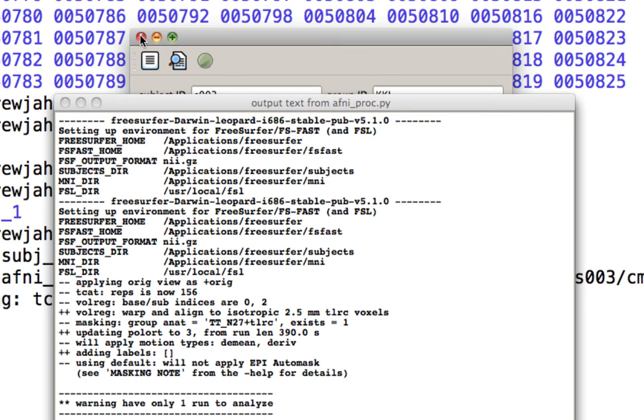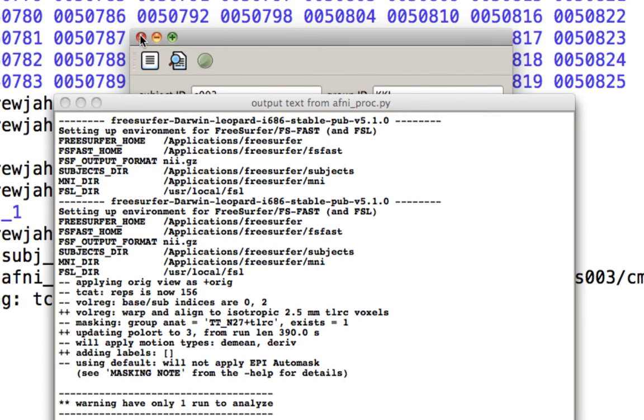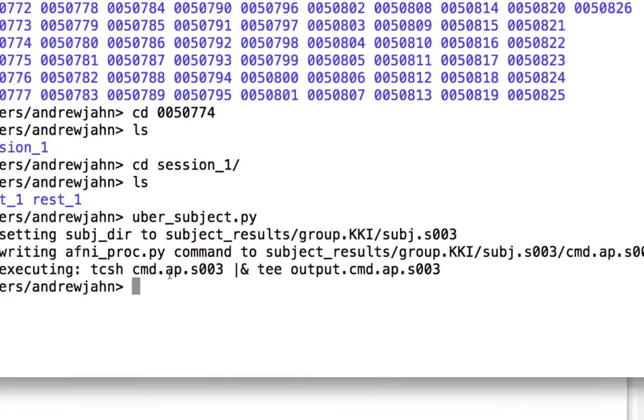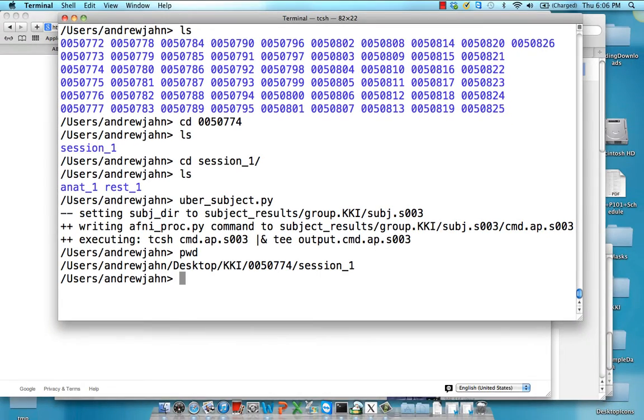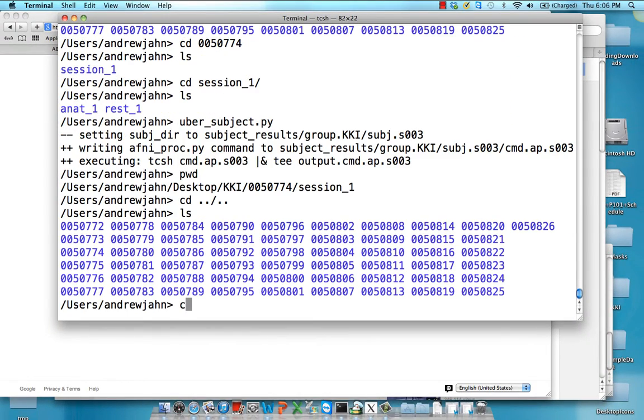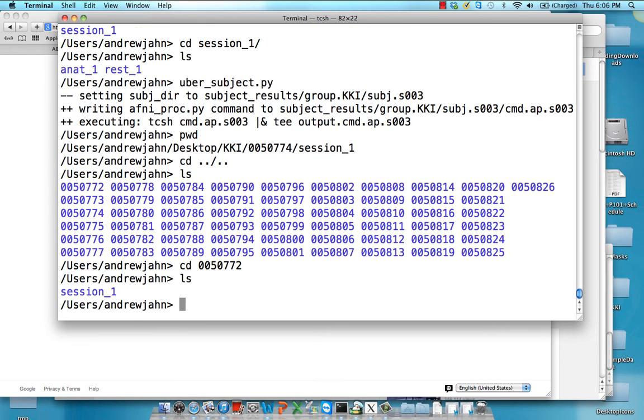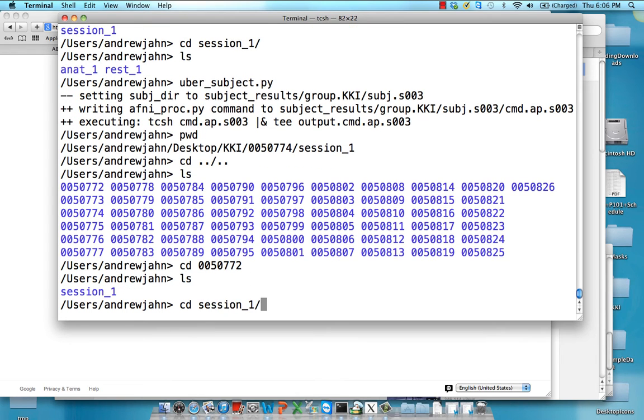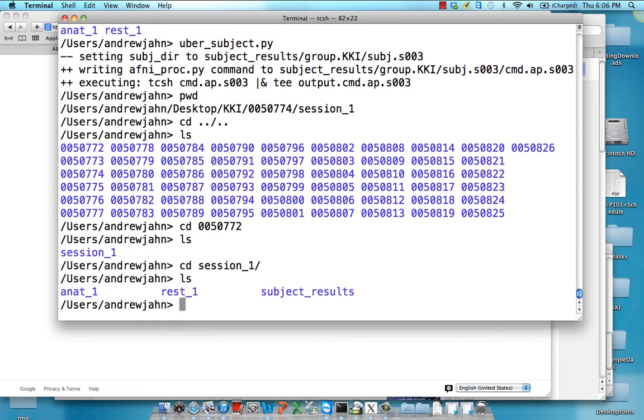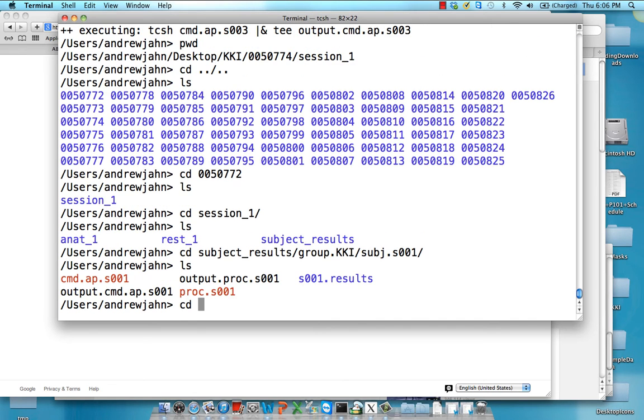Now it takes about five, six minutes. I'm not going to do that right now, but I'm going to show you what it should look like once we have it done for somebody. So here's somebody that I've already analyzed. And within this, after running uber_subject.py, it's going to create this entire directory tree for the results.